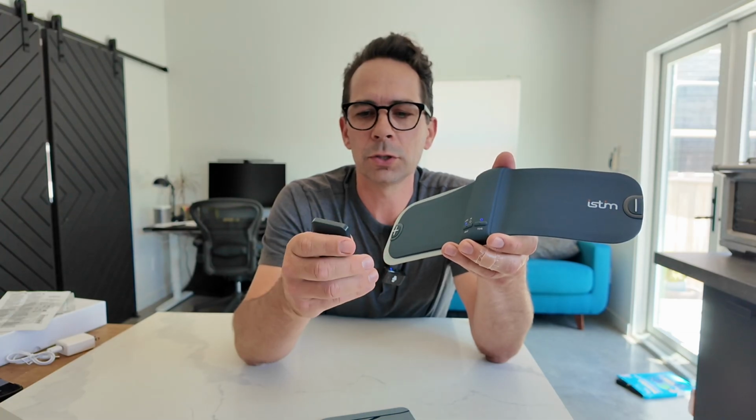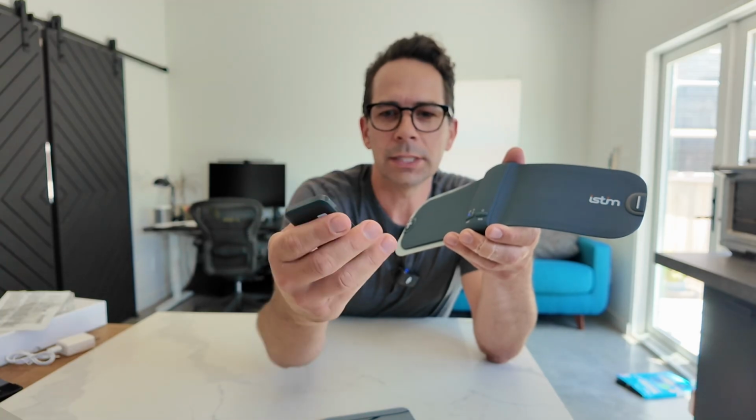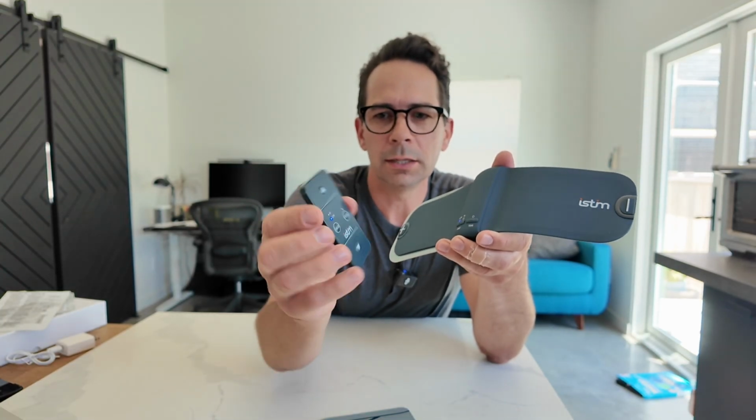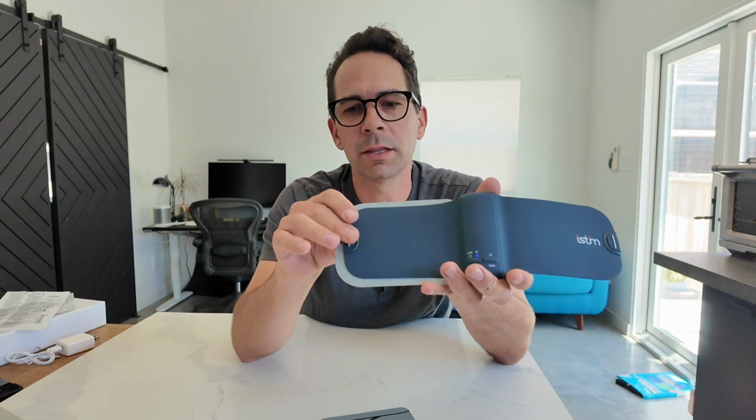To pair the remote, you just hold down a button on the remote for 3 seconds, and then you can see the light indicator on the remote is also illuminated. And once the remote's on, then you're able to change all the functions. There's also buttons on the device itself.